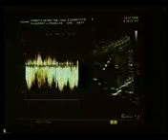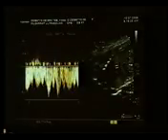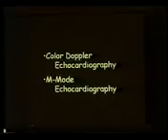So there you can see the same patient, same time, there is no problem. And that's why people overcall. Did you turn on your obstetrical setting? If not, then you have to.